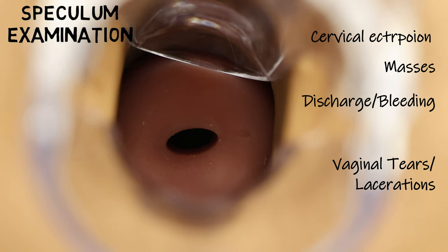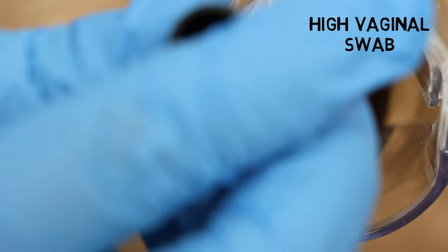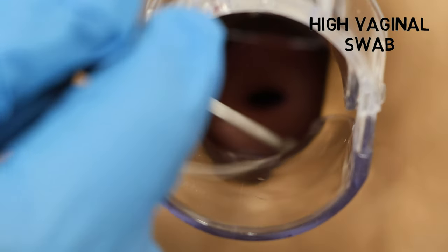Here I've also shown how to take a high vaginal swab. Essentially, we are guiding the swab into the posterior fornix, which is the location underneath the cervix.